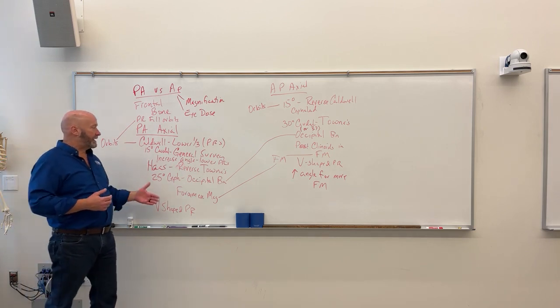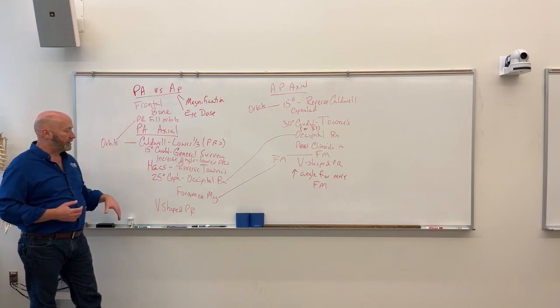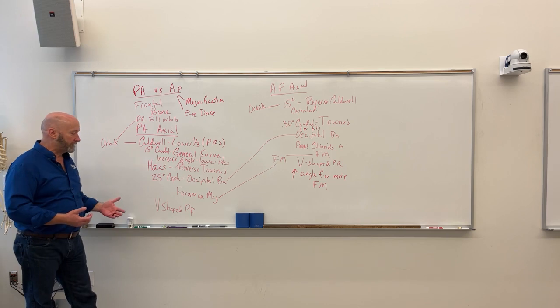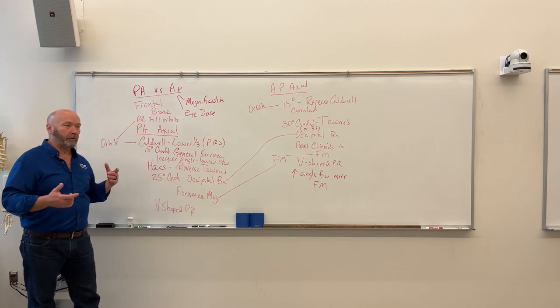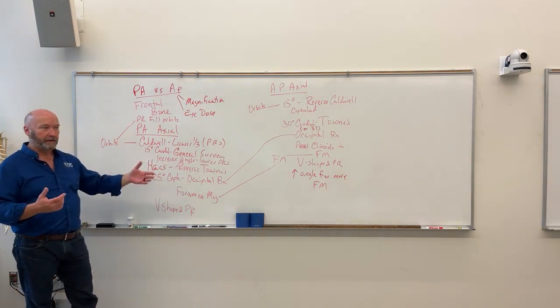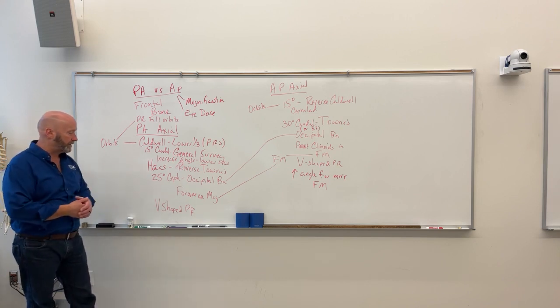So what we're going to see on the Haas that we're not going to see on the Caldwell, for the most part, is going to be the start of the foramen magnum. And what we want to see is a couple of things. We're going to see a portion of the foramen magnum. We're going to take a look at what happens if we increase the angulation on the Towns, not necessarily the Haas, but change the angulation on the Towns, what we're going to see here in a bit.